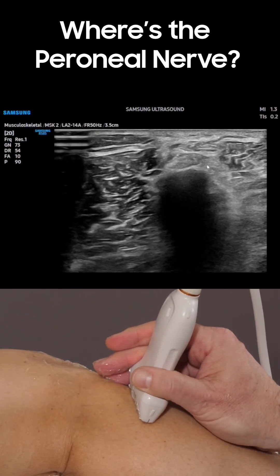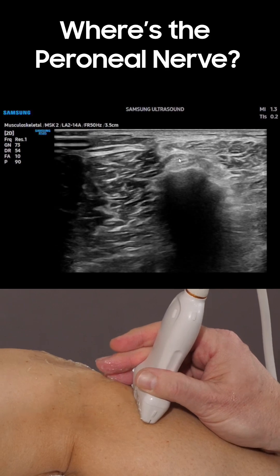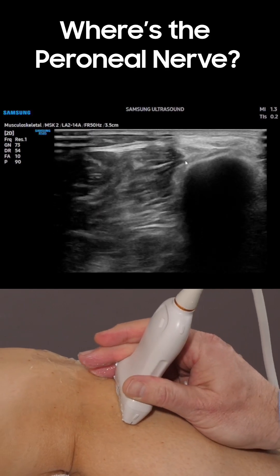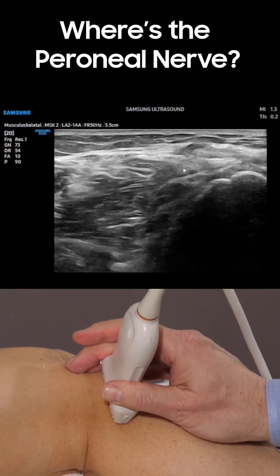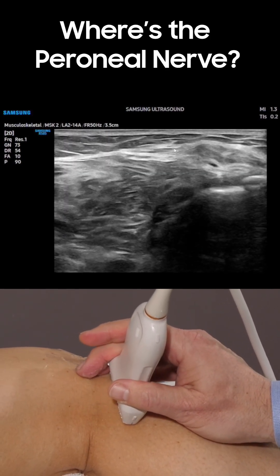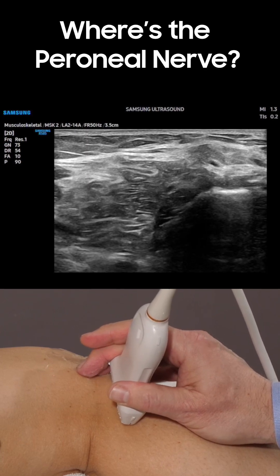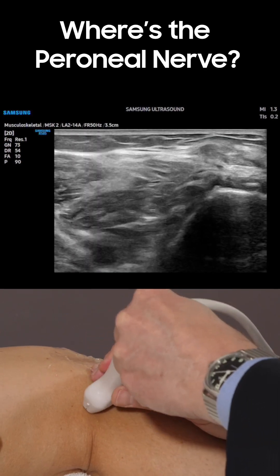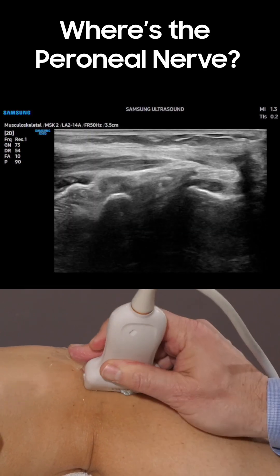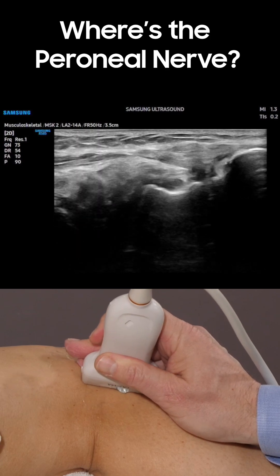It goes underneath the peroneus longus, which is a site of entrapment. But basically if we can identify the biceps femoris, the common peroneal nerve is directly posterior to that. Now you can look for that nerve — the common peroneal nerve — in long axis.